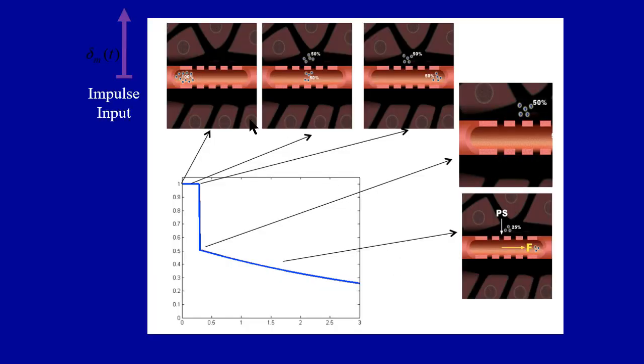So imagine that we can inject instantaneously a known amount of tracer into an arteriole and image this voxel repeatedly as the tracer passes through the tumor, leaks out and passes away from the tumor. But because our imager images the entire tumor and cannot resolve the individual spaces, the readout is actually 100%. It's only when the tracer flows away from the tumor that we get a sudden drop. And this drop depends on how much tracer has leaked out. And this is actually your first pass extraction fraction.